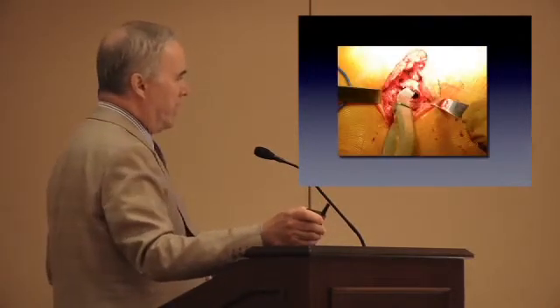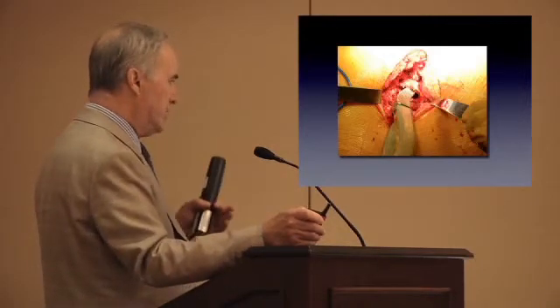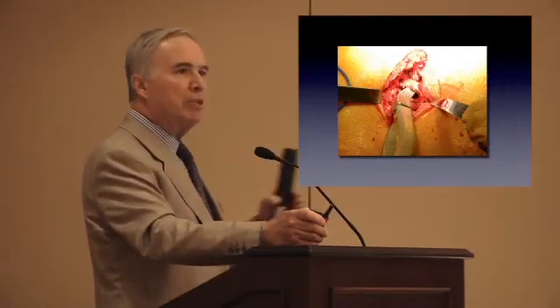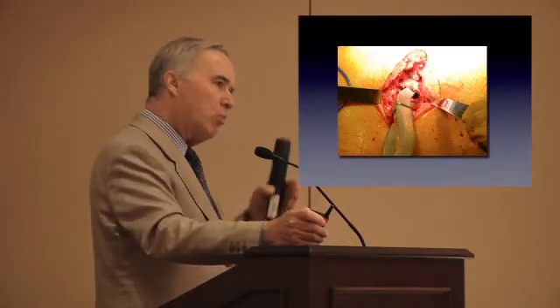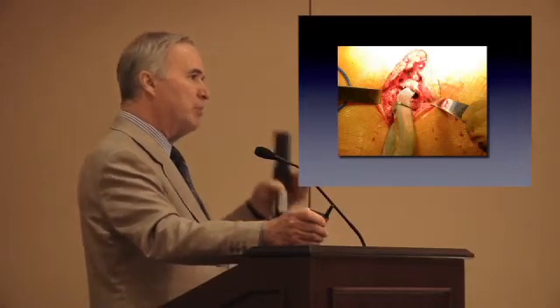My goal is, if I get a rasp in and the conical flare is flush with the bone, I could probably go up to the next size. Because I want to hang that conical flare on that cortical rim. I don't want to allow it to countersink. I want to hang that conical flare up on the cortical rim.